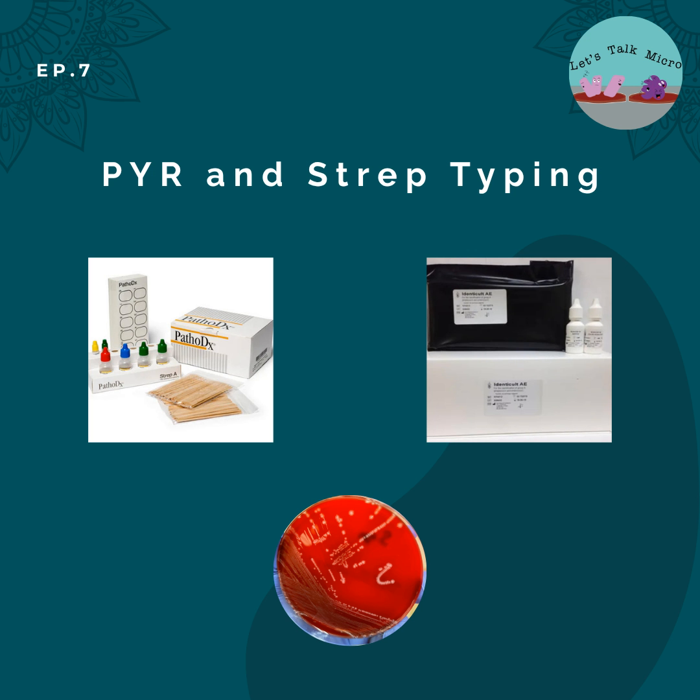Now, like I mentioned, Strep C and G can be either anginosus or dysgalactiae. At that point in time, you have to actually either do a MALDI-TOF or perform an ID to completely speciate it. I mean, you're between those two choices, then you need a formal method of ID to say, okay, it's anginosus or it's dysgalactiae.